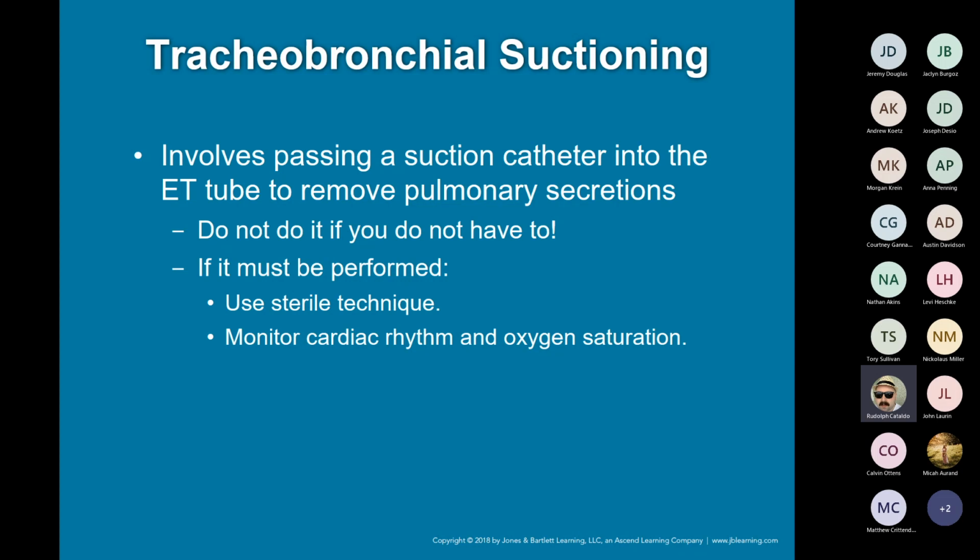Generally, we try to be as sterile as possible. I get it, in the back of an ambulance we're not very sterile, but just try to keep it as clean as you can. I mean, don't use a dirty suction catheter that you just dropped on the floor or something like that. Try to be as sterile as possible when doing this.